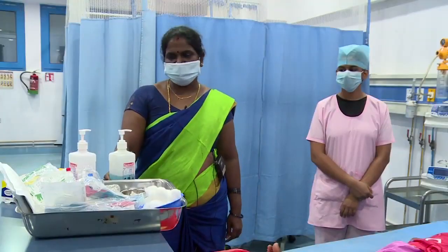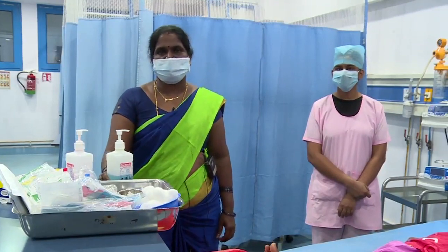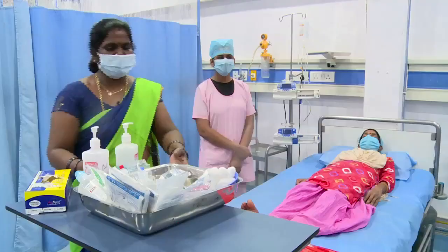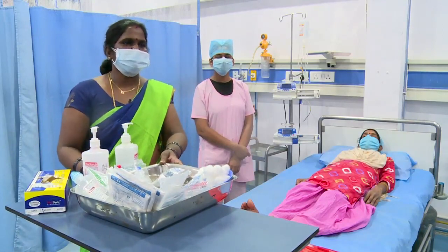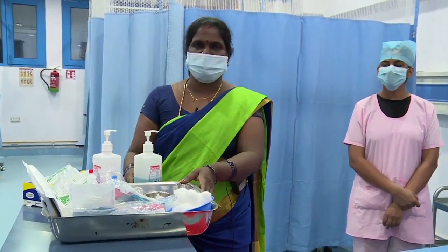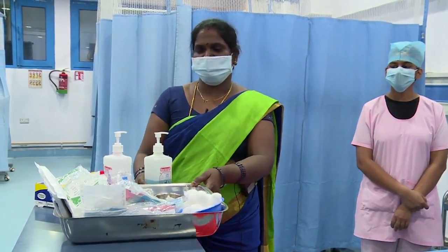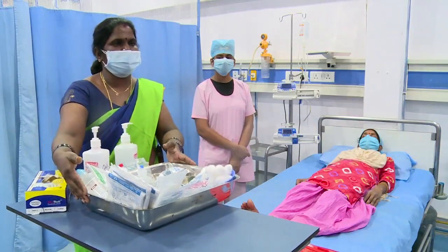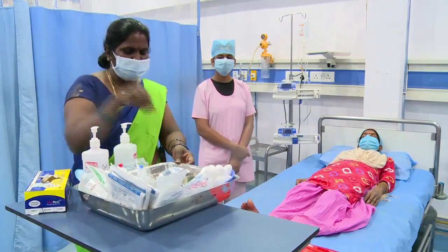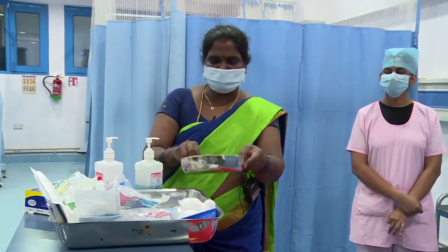Today we are going to demonstrate intravenous bolus administration in a critical care area. For the procedure, we need to think about what articles are needed. A stainless steel tray contains the articles needed to carry out the procedure, including a stainless steel kidney tray for collection of the waste from the procedure.